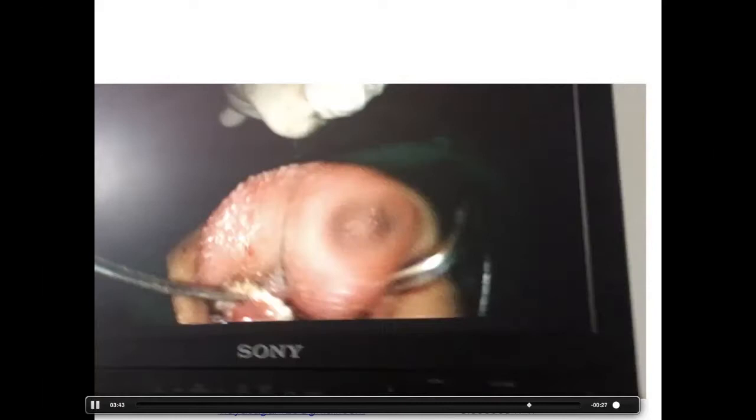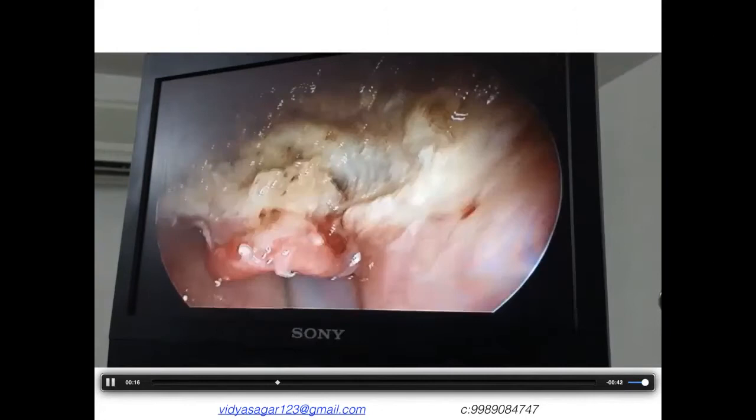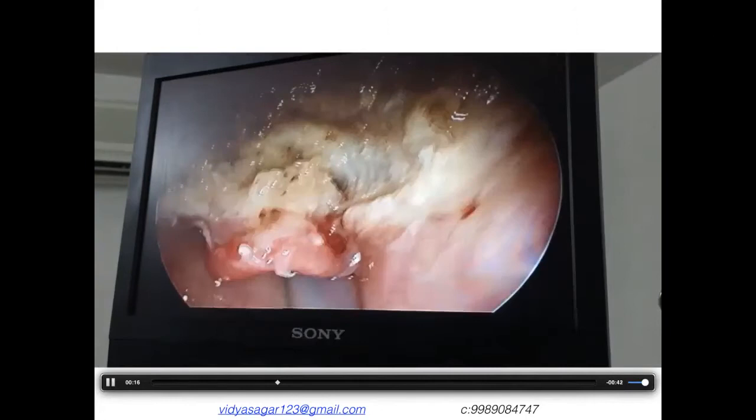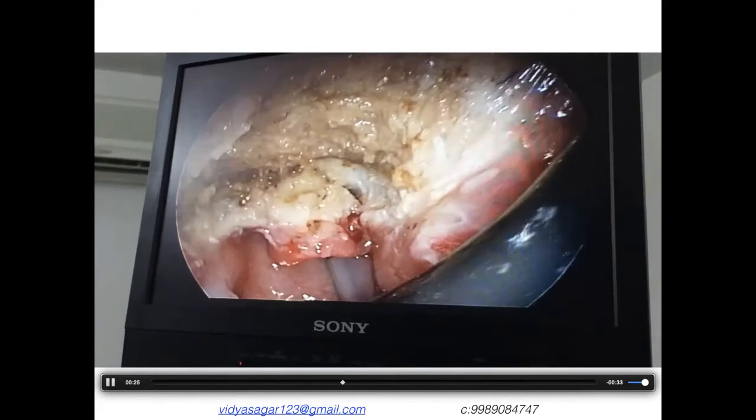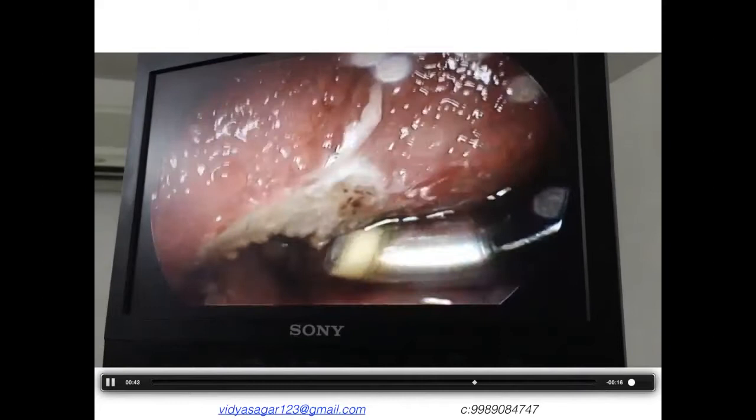We excised the lesion in total without causing any thermal damage to this child. The entire vallecula and tongue base were completely devoid of bleeding — beautiful hemostasis achieved with the coblator coagulation wand. We kept the child overnight intubated, examined on day one to confirm no bleeding or edema, and then extubated.